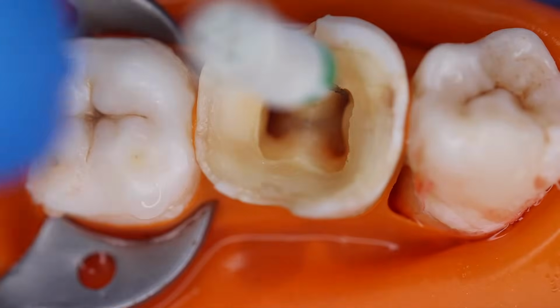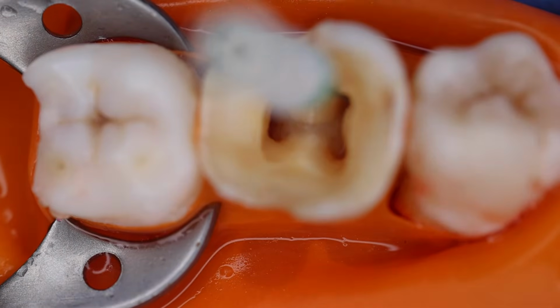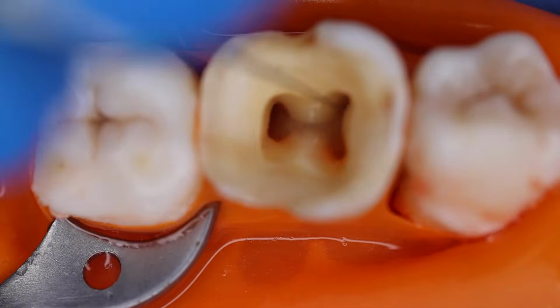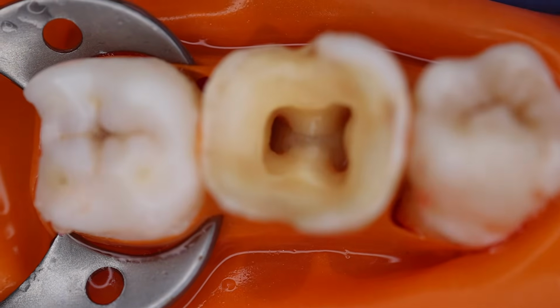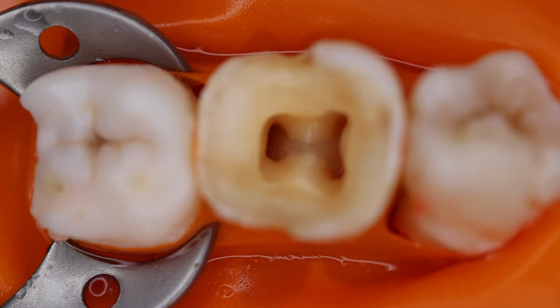and go inside the mesolingual canal orifice. So you could easily negotiate all these canals, and once you have negotiated, you have entered with the file. This is the time you would initially irrigate your root canals with the first irrigant, that is the sodium hypochlorite.